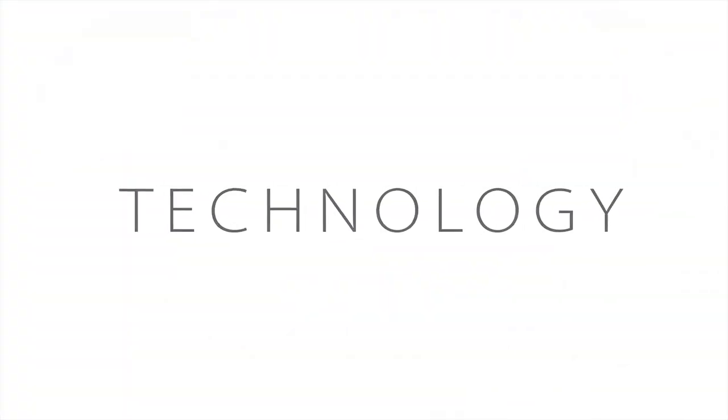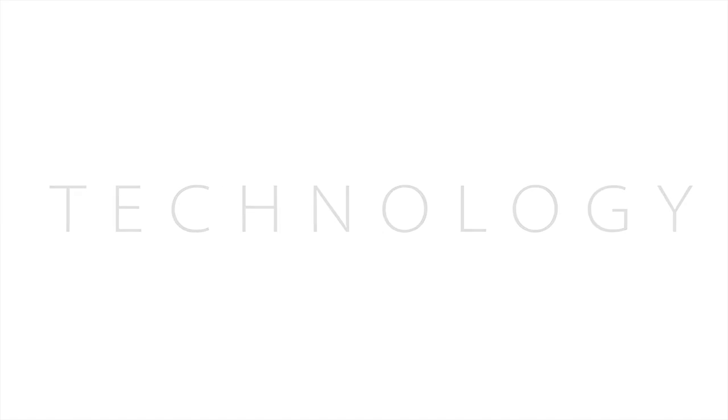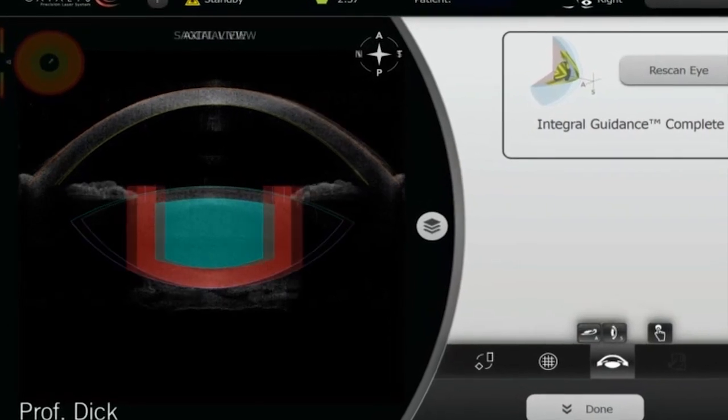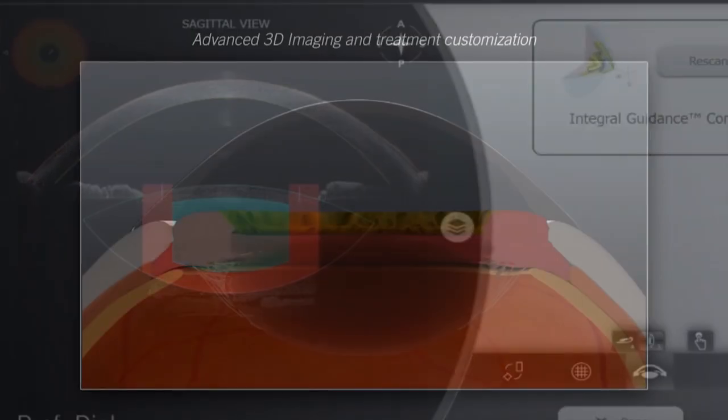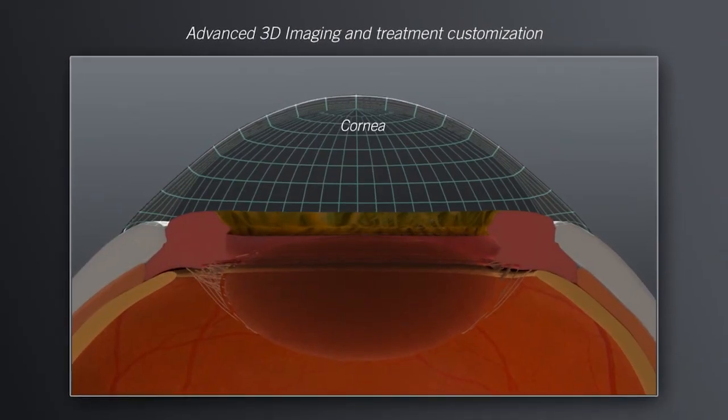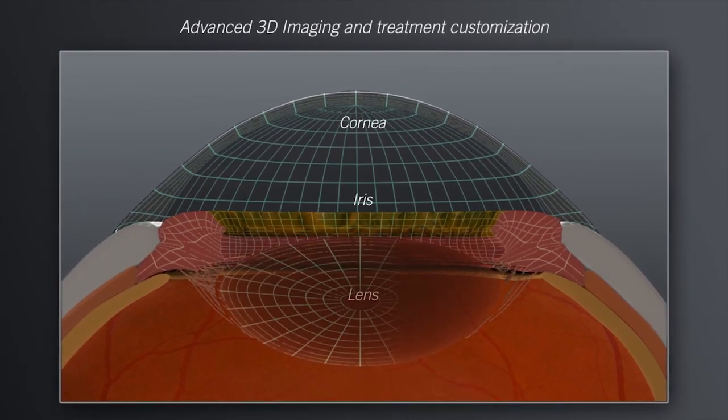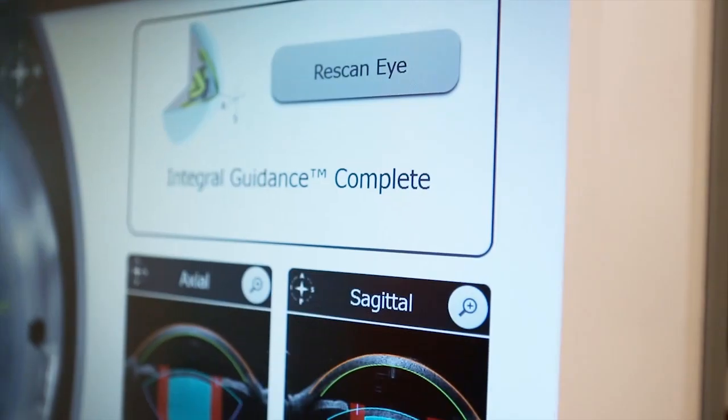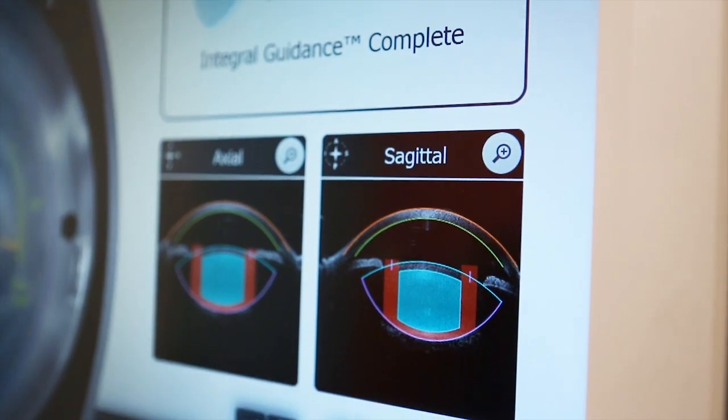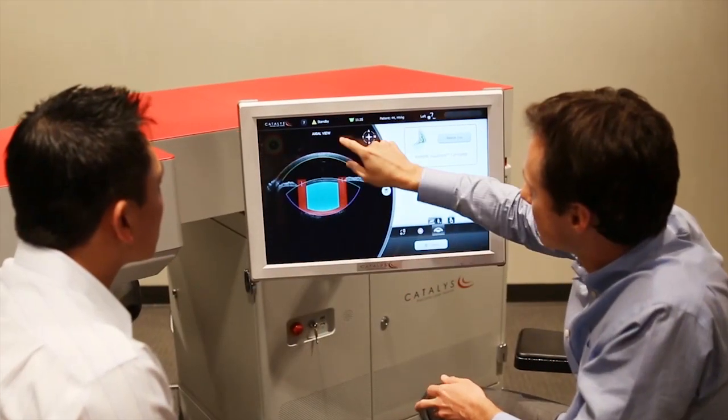The integral guidance is probably one of the most exciting aspects of the system. We've incorporated high resolution OCT imaging and then combine that with sophisticated algorithms that are able to recognize all the features of the eye, both surfaces of the lens and both surfaces of the cornea automatically.